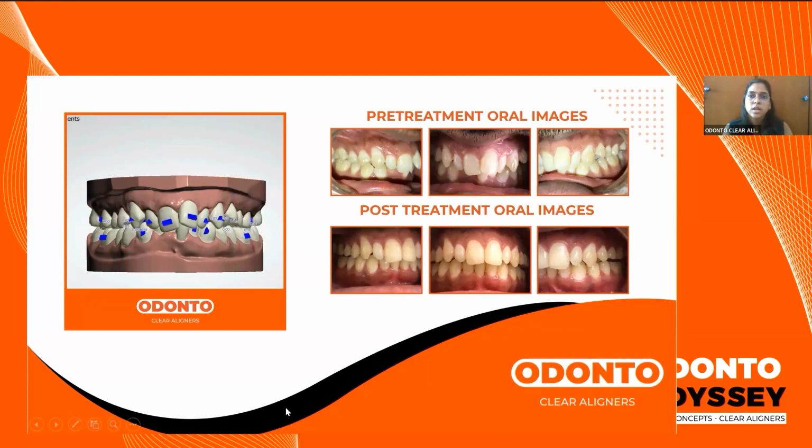We can also notice out here that we have laterals which are not exactly peg laterals. The one on the left can be said to be a peg lateral. These teeth may require some amount of composite buildup for aesthetic purposes. If the space is not adequate, it cannot be balanced.